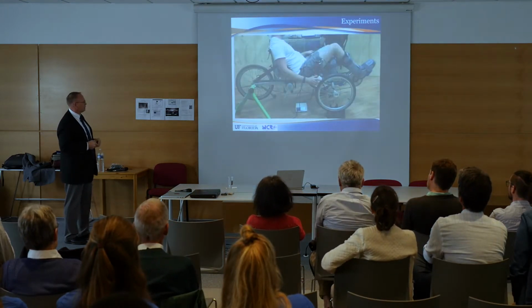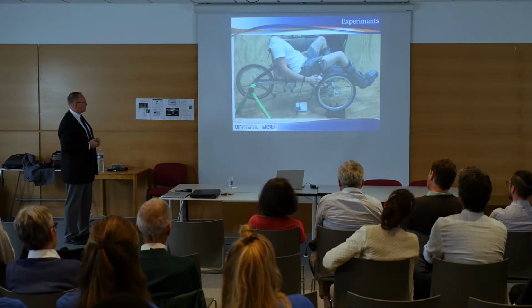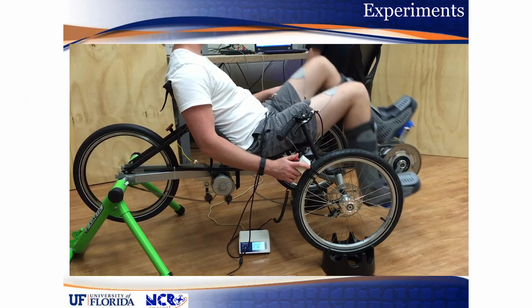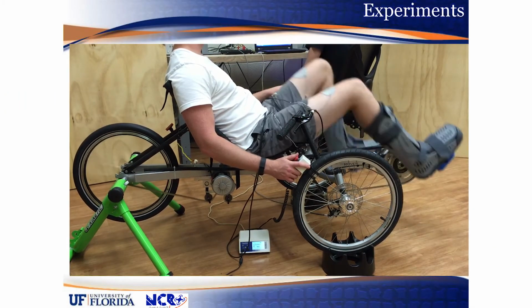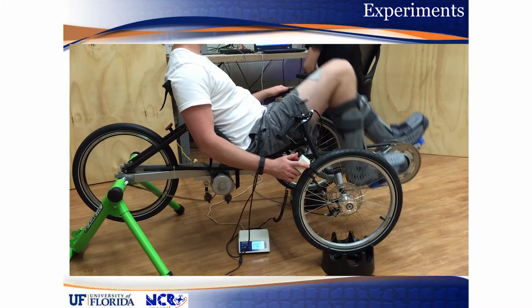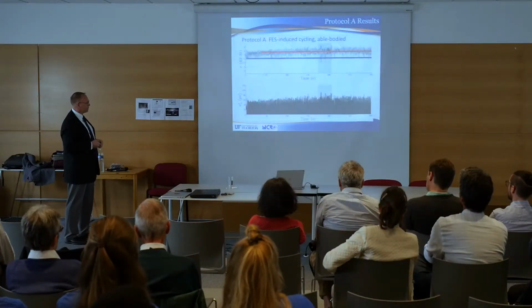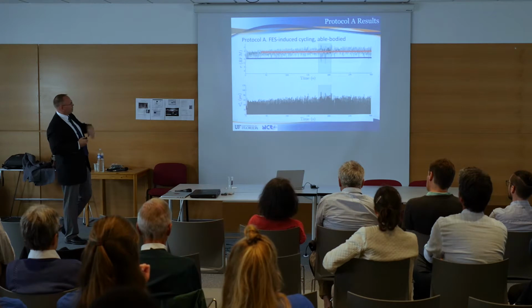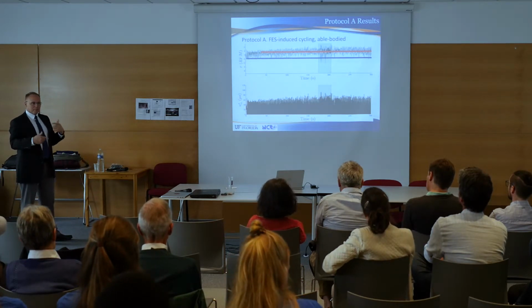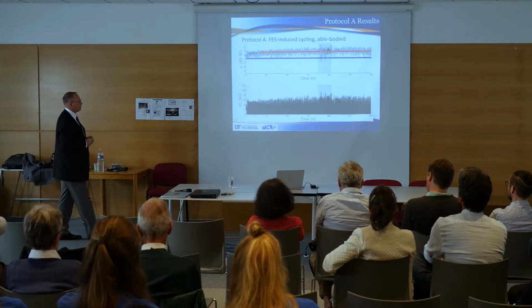So we did some experiments. This is just a video of a healthy, normal person following the protocol. Unfortunately, we didn't have videos in this experiment of people with neurological conditions. But our first protocol was able-bodied cycling, meaning that we had people without conditions. Healthy normals is a term that could be used there.